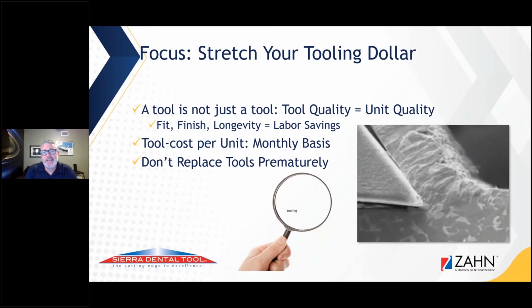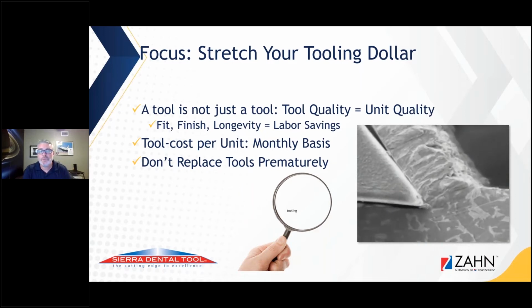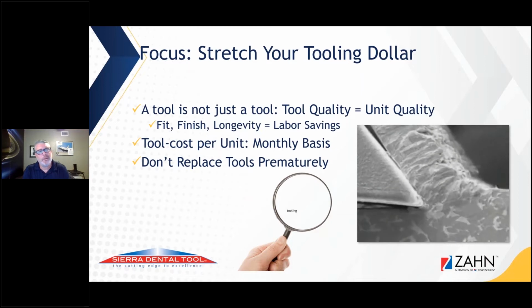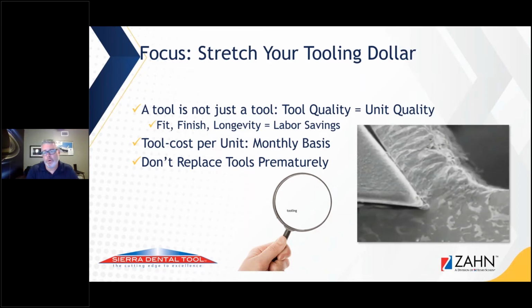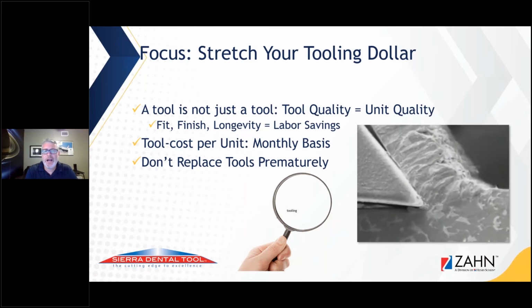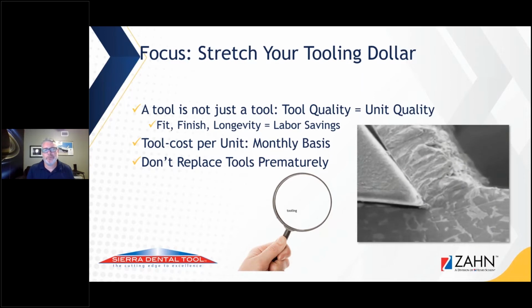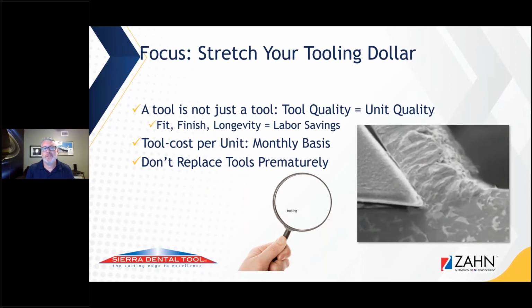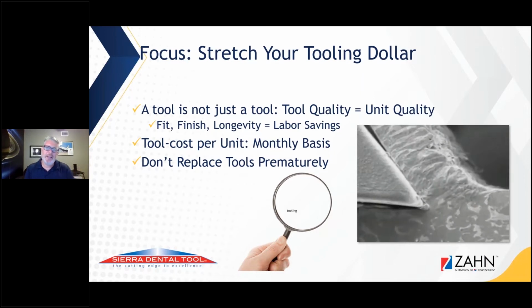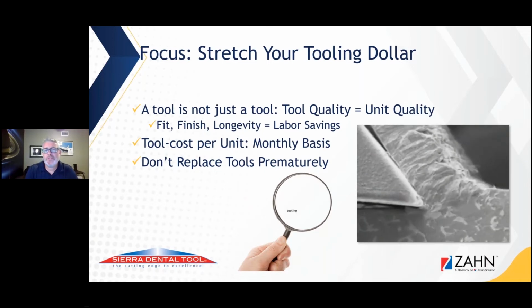The big thing I see when I get phone calls is people replacing the entire set of tools when it was pretty much the 1 millimeter that did all the work, or the 2 millimeter that gouged or did too deep of a cut, and now it's got some damage to it. But then you're milling all these restorations, and everybody always replaces all the tools all at once. It's better to take steps on paying attention to the units and seeing what's coming out.